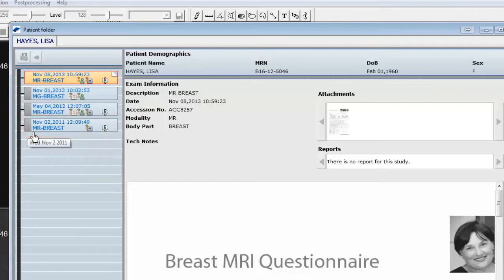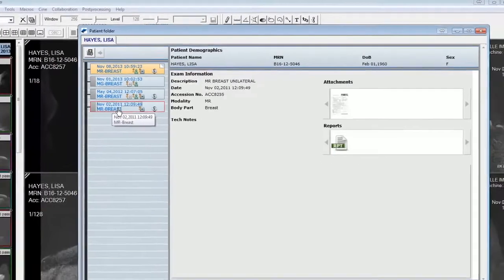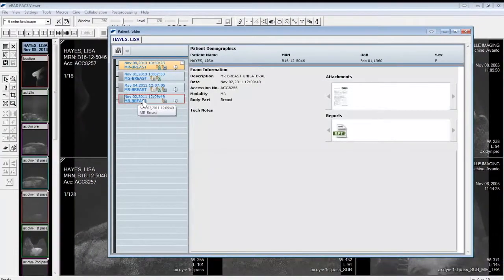To view the report, select the timeline item. Click on the report icon in the report section of the patient folder to display report content in the image area.